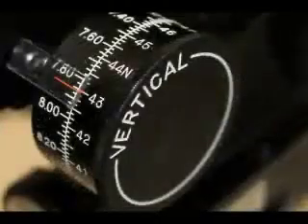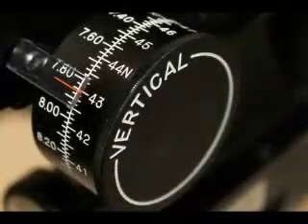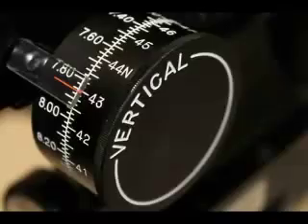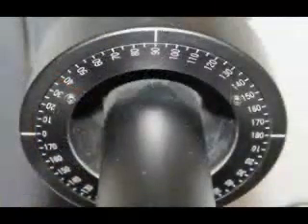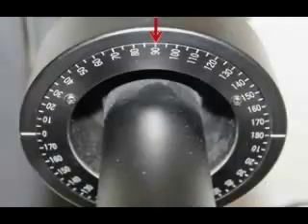The scale of the vertical measuring drum indicates the dioptric power of the cornea along the vertical meridian. The meridian indicators on the axis scale are white lines. Vertical axes fall plus or minus 20 degrees around 90.